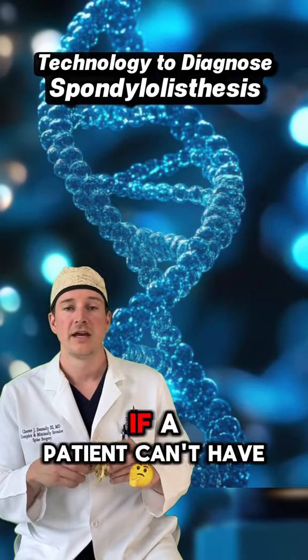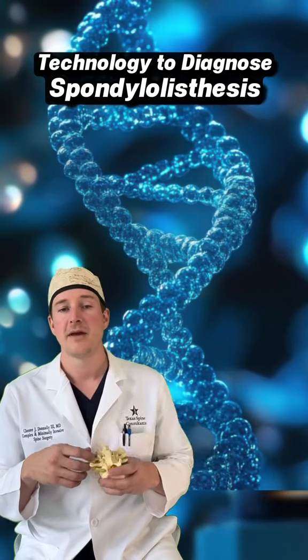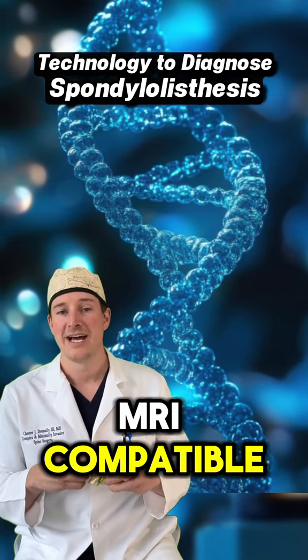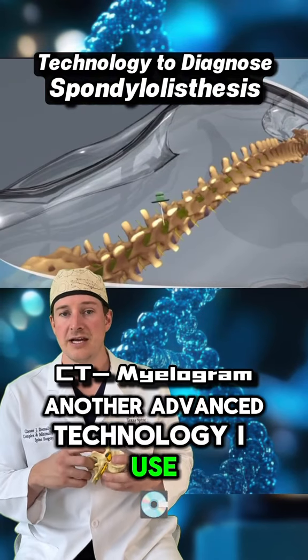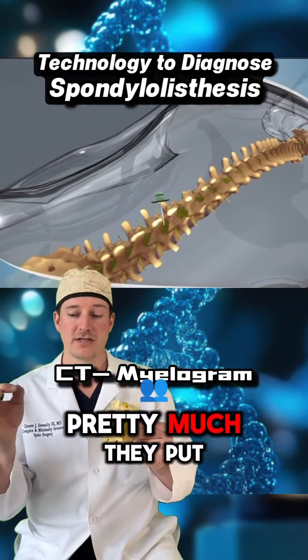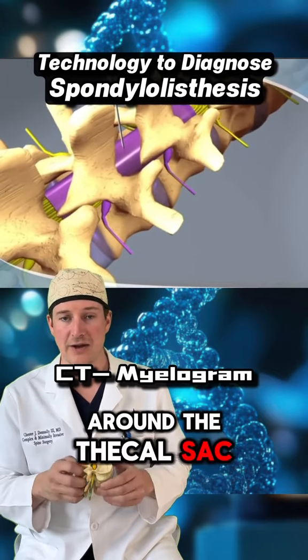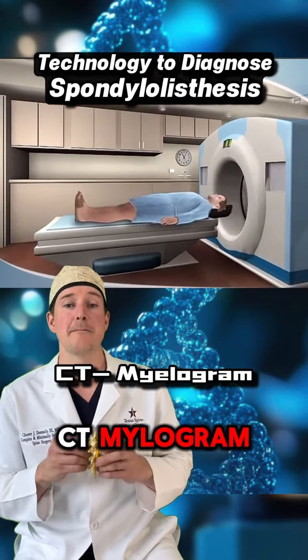If a patient can't have an MRI, maybe they have severe claustrophobia, maybe they have a pacemaker or some other metal implant that is not MRI compatible, a CT myelogram is another advanced technology I use. It's somewhat uncomfortable. Pretty much they put a needle into the back, you put dye around the spine, around the thecal sac, around the neural elements, and then you get the CT scan, and that's called a CT myelogram.